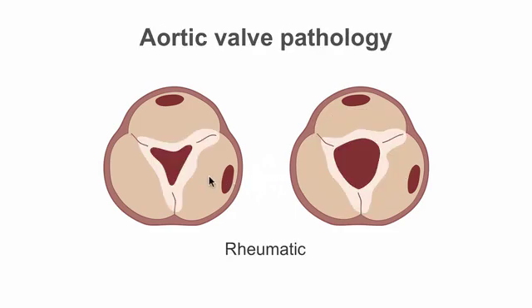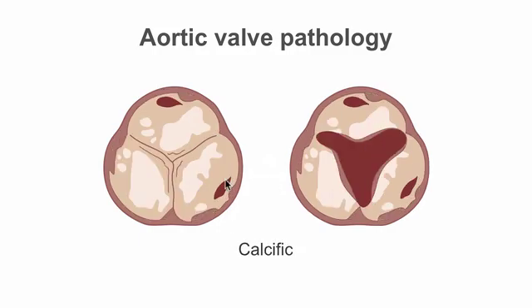In rheumatic heart disease, the aortic valve may become calcified, particularly at the base of the commissures, and this can result in aortic stenosis or aortic regurgitation. In calcific degenerative aortic stenosis, we often see diffuse calcification of the valve leaflets, and this causes a reduction in leaflet opening during systole, leading to aortic stenosis.